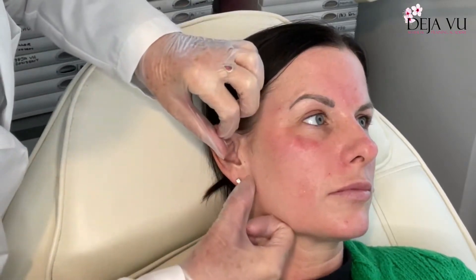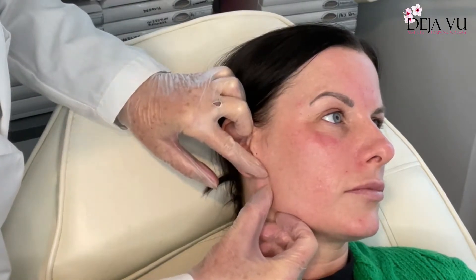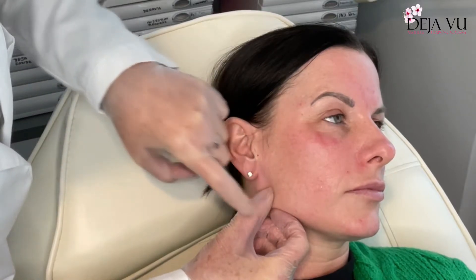So let's get onto the chin. Another sign of beauty is that you should have a nice square jawline. Men's are more square than ours, so what I'm going to be doing is squeezing this and injecting down to the bone there.